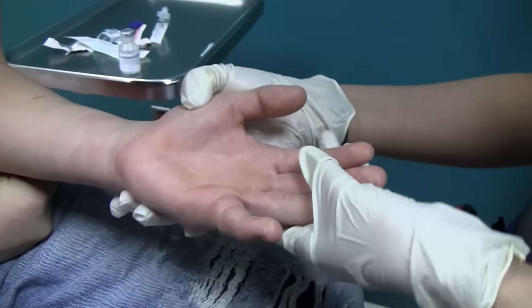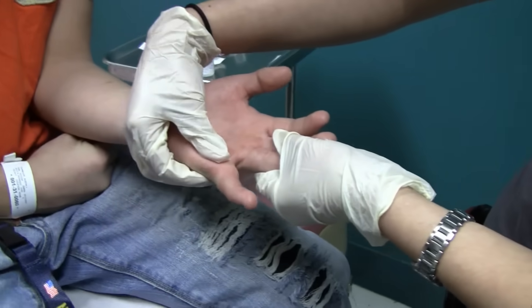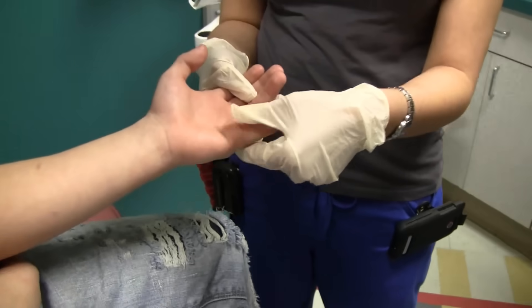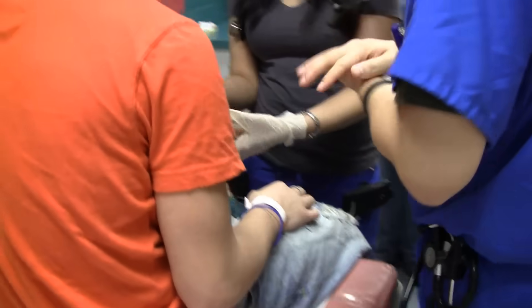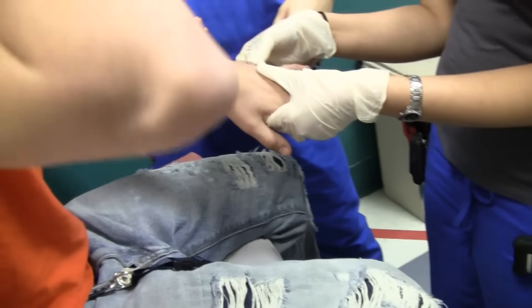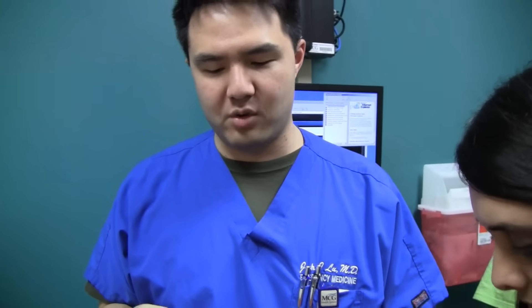And I've now gotten a phone call in the middle of this — and that's what's supposed to happen, telephone calls in the middle of the procedure. I can still feel it slightly. I can't really feel that. Is it numb? Yeah, pretty much. How's that when we're pushing on it? I can feel it around in here. Okay, that should be fine. So for the reduction, we're going to start proximal over the extensor tendons, pull on them to get some traction because they've shortened down. Once we get to that, it should pop in pretty easily, otherwise you're kind of forcing it over.